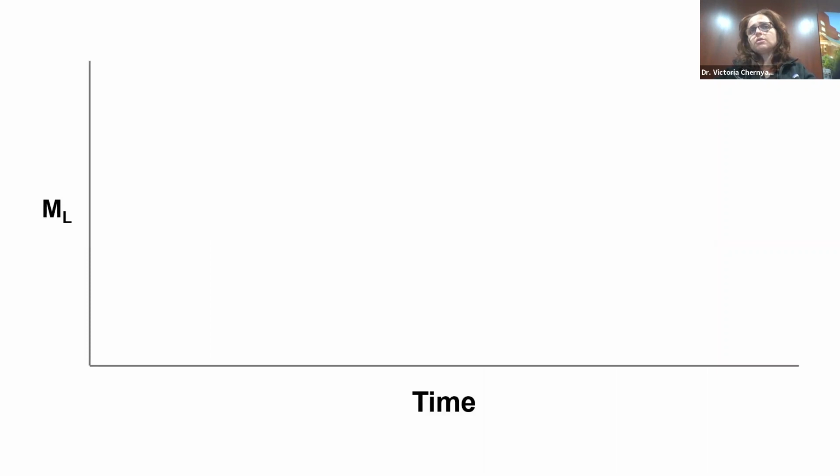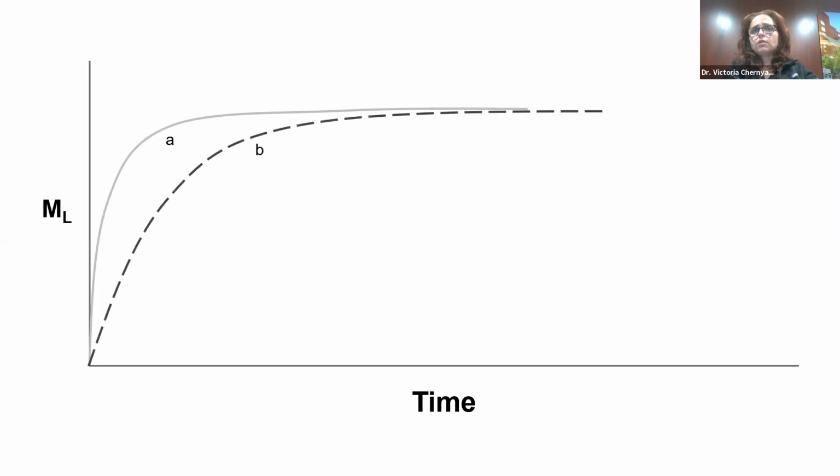So when people talk about MR, you will hear a lot about T1 and T2 weighted images. So let's take a look at what these numbers mean. If we look at the magnitude of longitudinal magnetization over time, the recovery of the signal has this curve, and how fast this curve goes back to normal depends on the tissue.